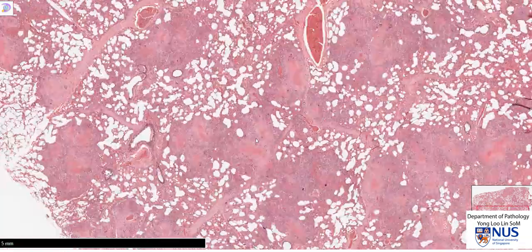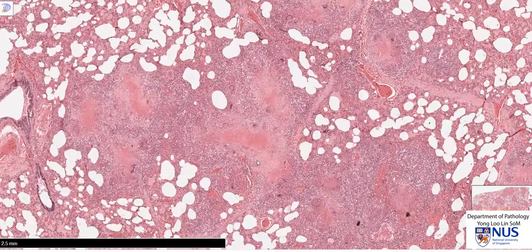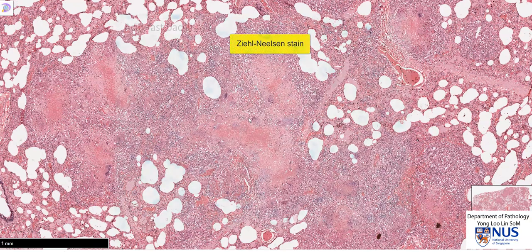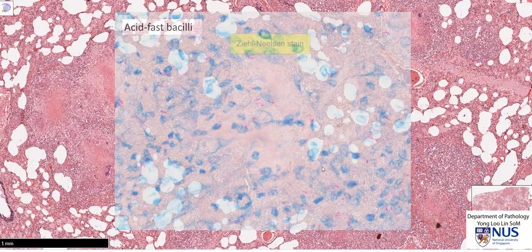Typically, when the pathologist reviews a case like this, we would do a special stain, which is the Ziehl-Neelsen stain. We would scrutinize the section very carefully, particularly in areas of necrosis, to look for acid-fast bacilli. And of course, if this tissue is cultured, it will likely yield mycobacteria as well.